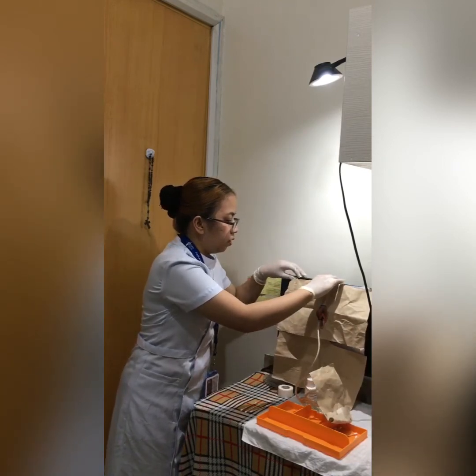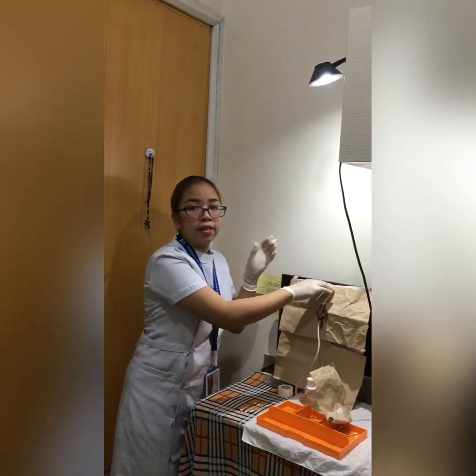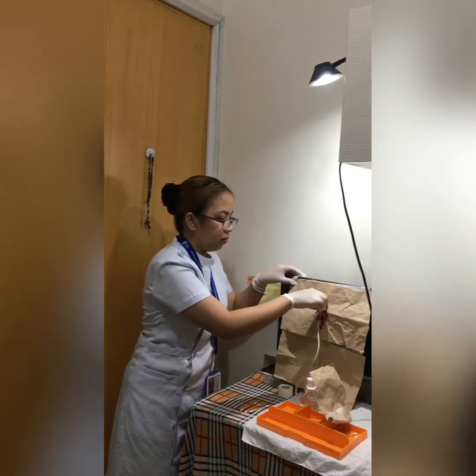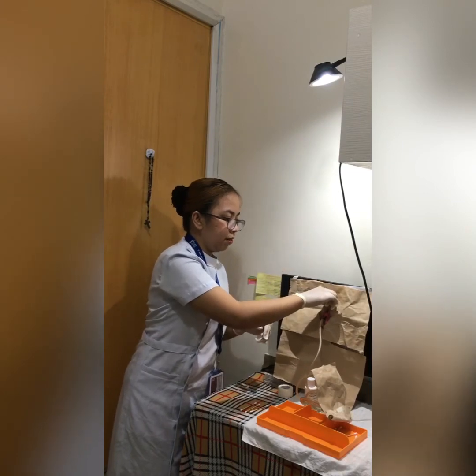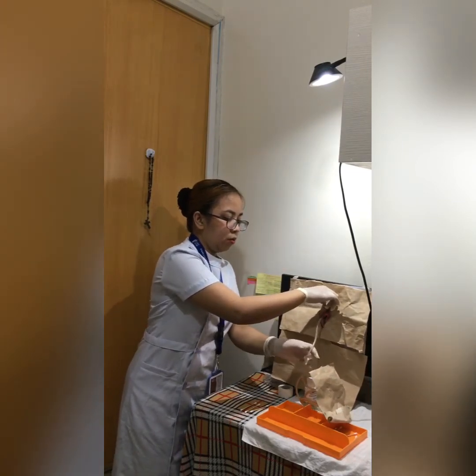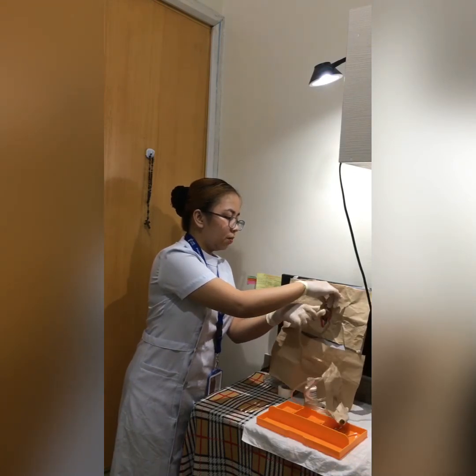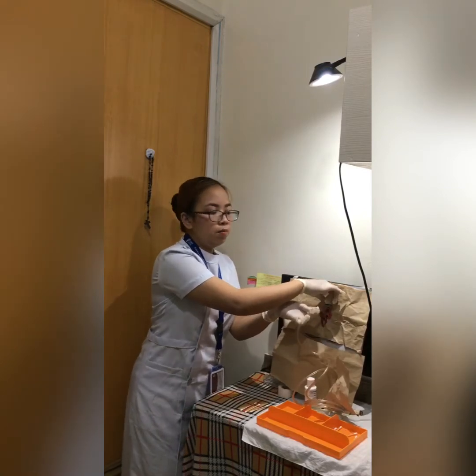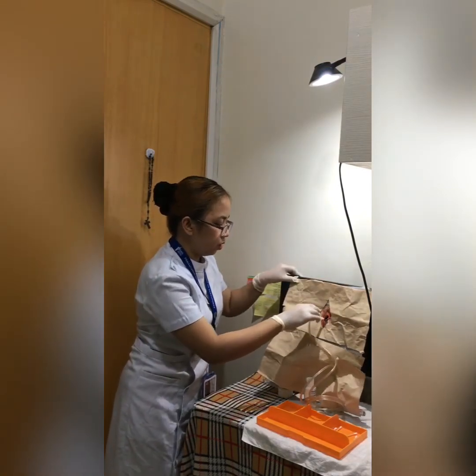Assuming that there is a urine flow, check for the continuity and the color of the urine. Then after that we have to advance the catheter around 5 centimeters or 2 inches to get the catheter into the bladder of the client.